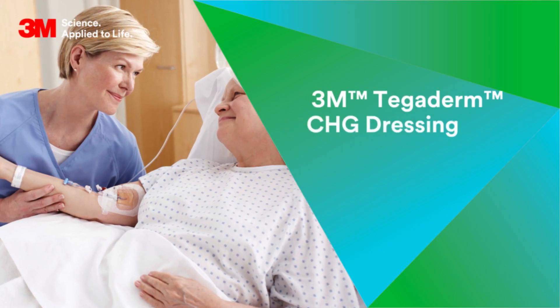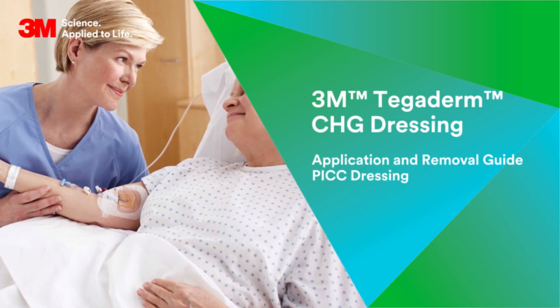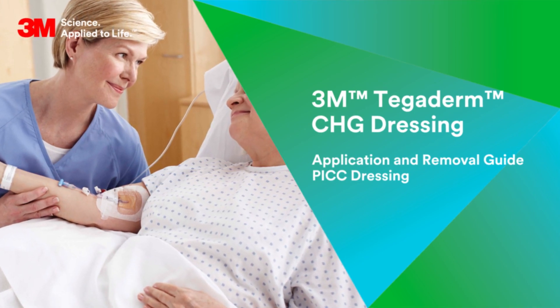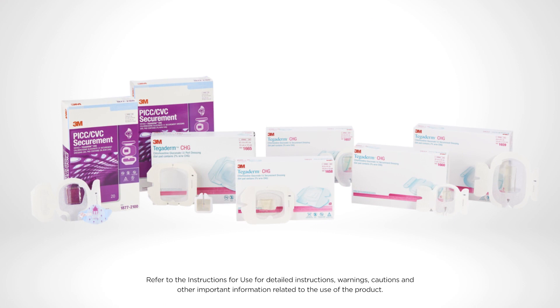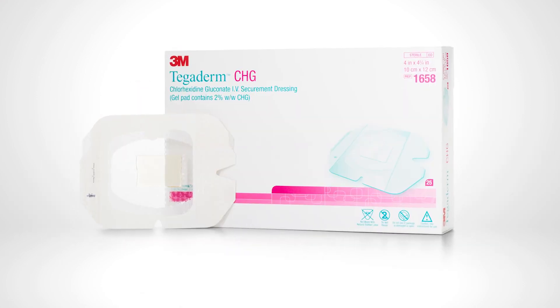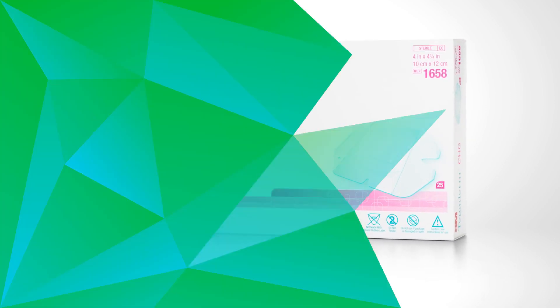3M Tegaderm Chlorhexidine Gluconate IV Securement Dressings are an all-in-one antimicrobial transparent film dressing. They are available in many sizes to meet the varied requirements of central venous catheter sites. This video will demonstrate catalog number 1658 applied to a peripherally inserted central catheter.